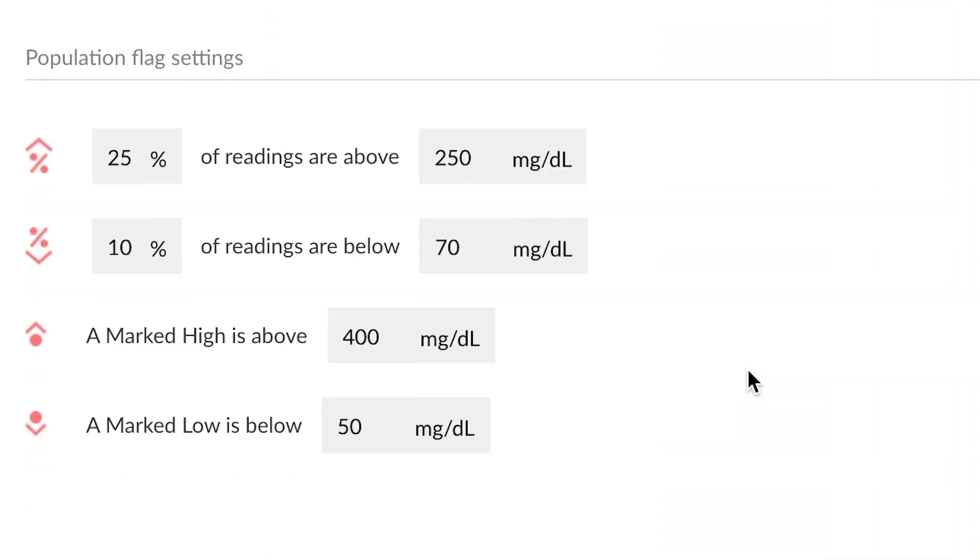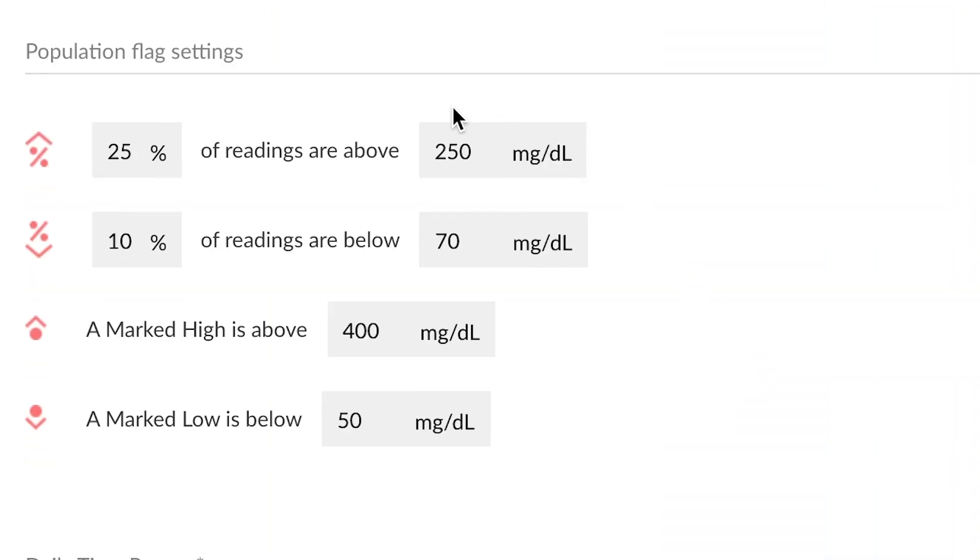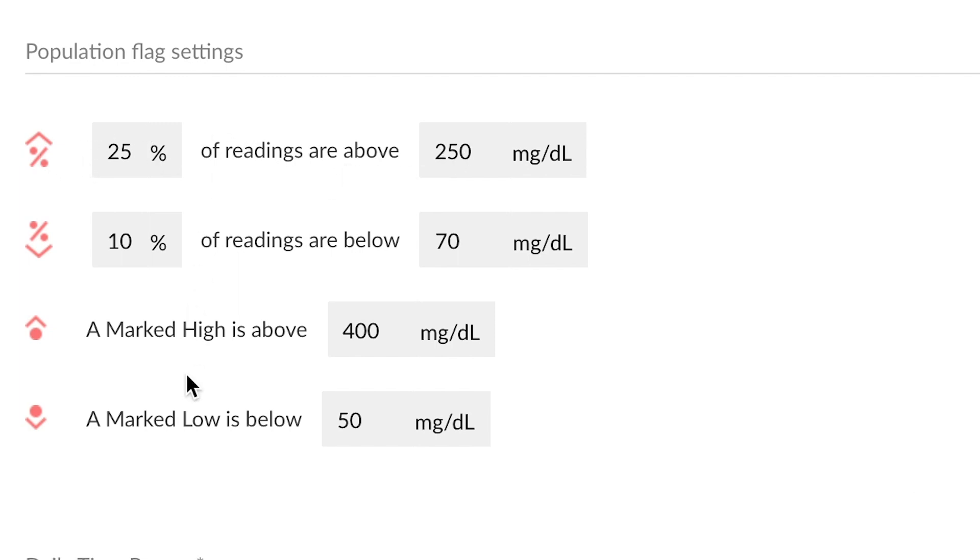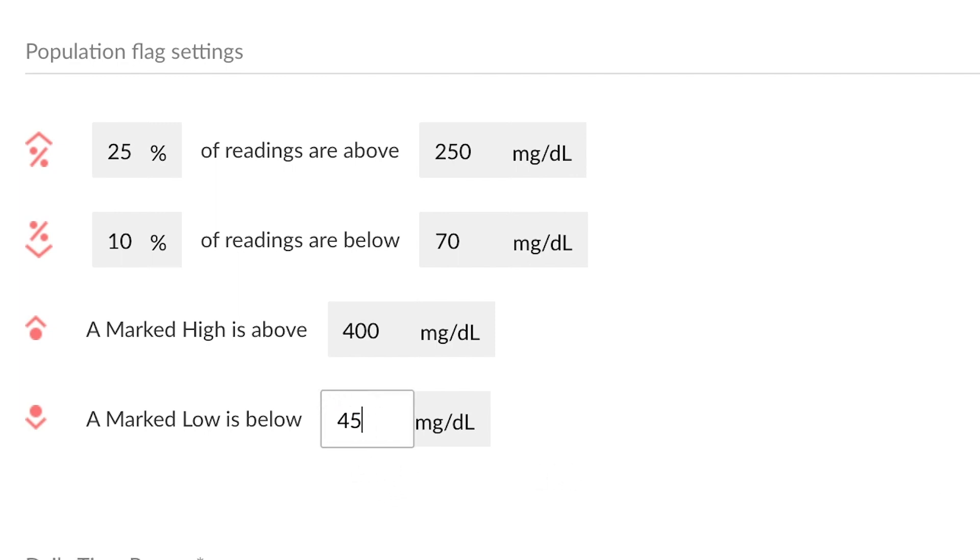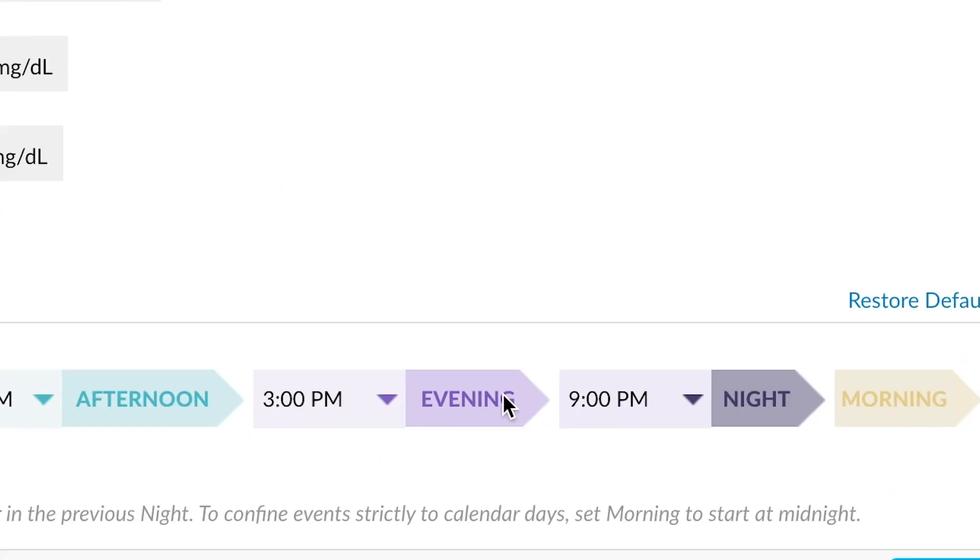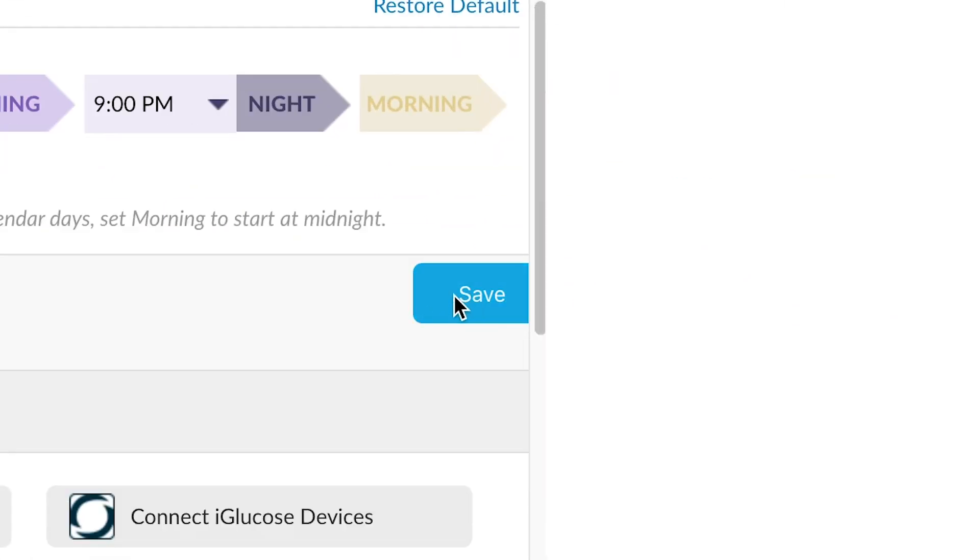Scrolling down to population flag settings, this section allows us to indicate when we show certain markers on a patient account. So for instance, for this patient, if 25% of the readings are above 250, we're going to show this flag. Similarly, if 10% of the readings are below 70, we're going to show this flag. Additionally, we also have the option to flag if certain values are higher or lower than a certain value, and this is all changeable. Let's say you wanted to change this value to 45 instead. You could simply type that in. Make sure you push the save button to save it at the end.